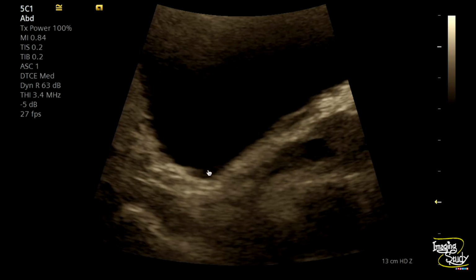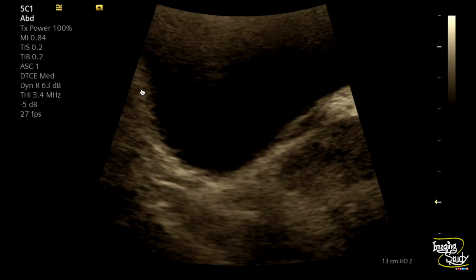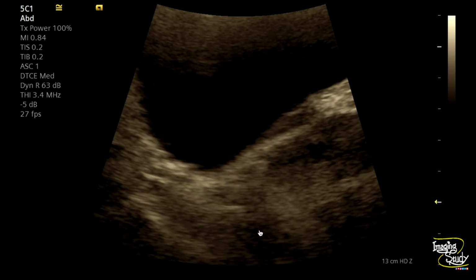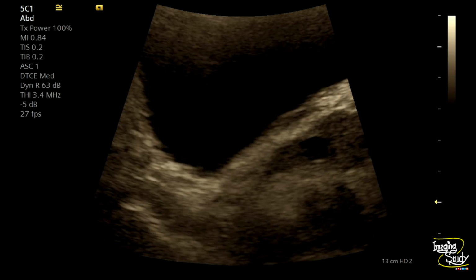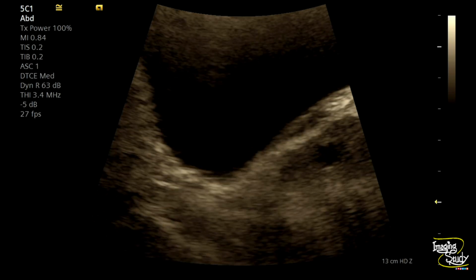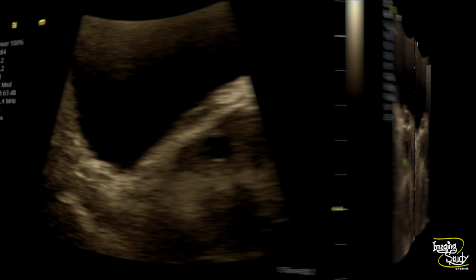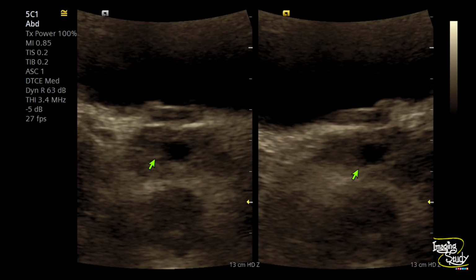And also adjacent urinary bladder wall is important. If it was due to the obstructive cause, the wall may get thickened due to the inflammatory process, which didn't happen here also. So this is nothing but a prostatic cyst. Here's the picture. You can see this cystic area at the prostatic parenchyma. It is situated at the midline.